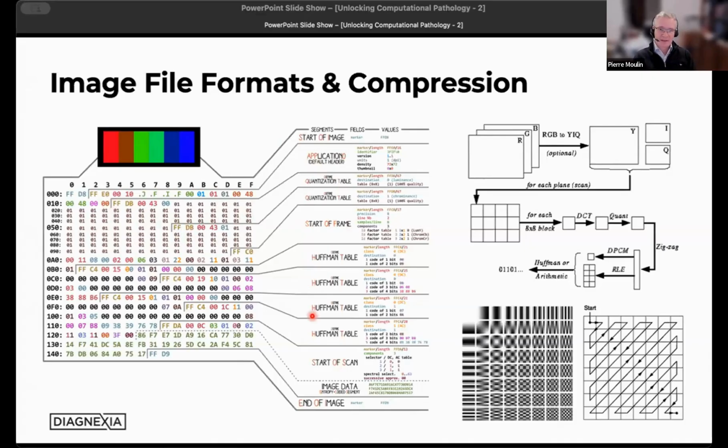So there are many formats that exploit several strategies to write different important elements of the images, or to indicate to the reader, now you have to jump over to this point in order to be able to start reading the red image, and you have to jump over to this point to read the green image. This is one possibility, especially in multiplex files.